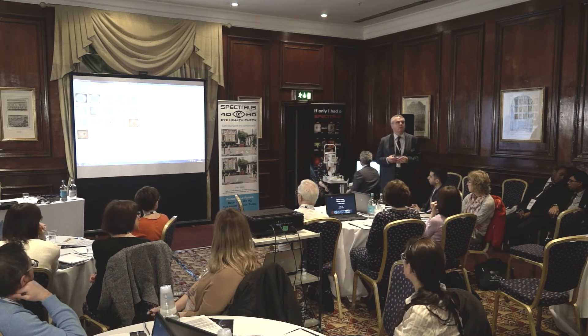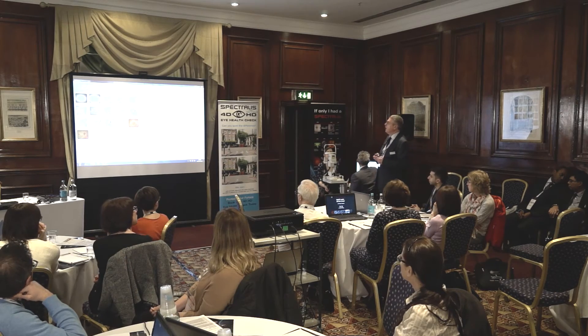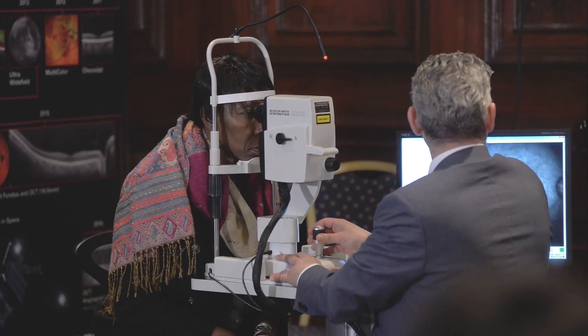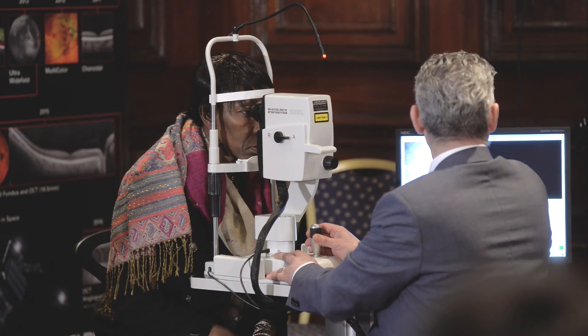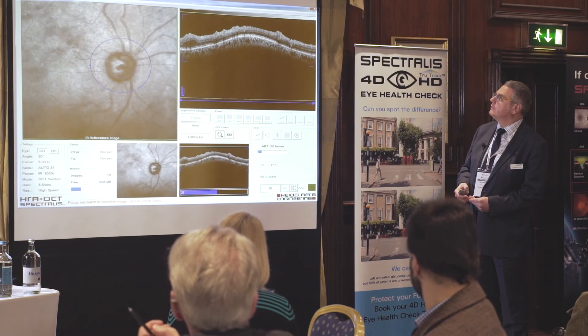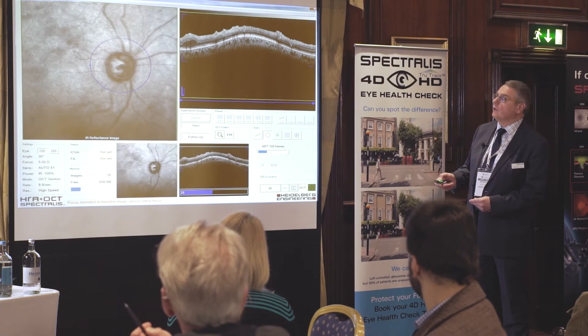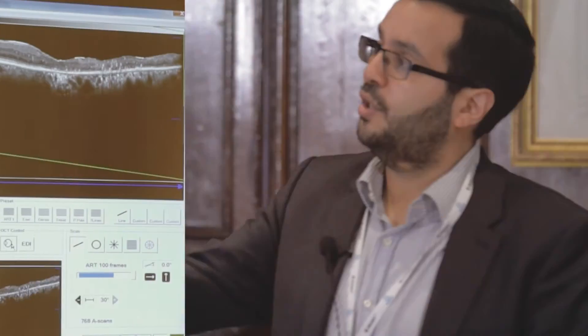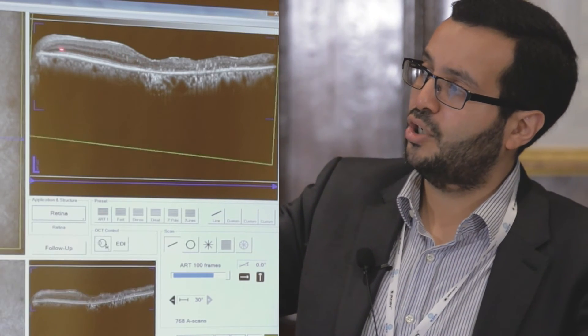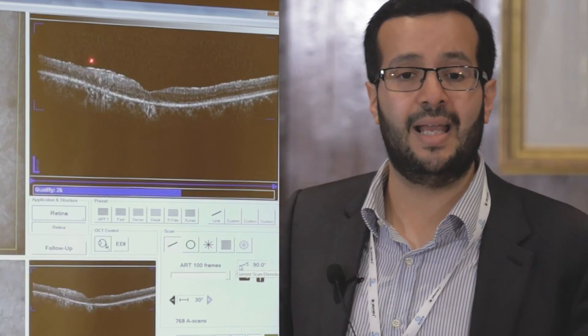So we've had a chance to look at the normal, and we're now going to move on to our cases. This lady's got a lot going on. She had a left macular hole in 2012, then she had a left eye inferior retinal vein occlusion in March 2013. We're going to eye track again and let the quality build, so we get a really good quality scan for segmentation. You've got preserved inner segment and outer segment junctions there, which delineate the photoreceptors.